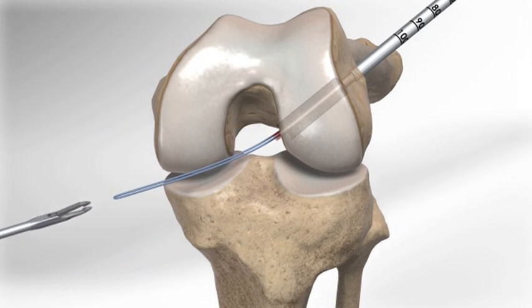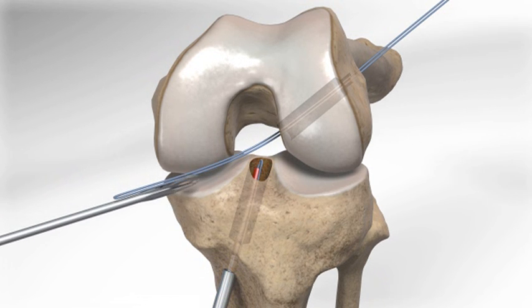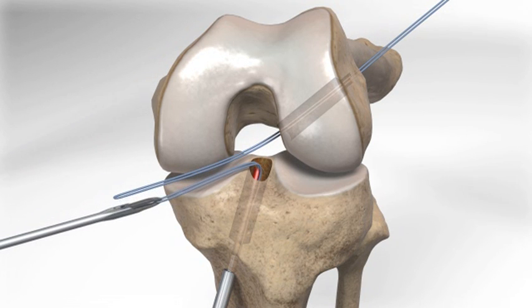Using the flip cutter again, a socket is then drilled in the area of the ACL attachment to the leg bone, or tibia. A suture is also passed into the joint and out of the skin for tibial graft passing.